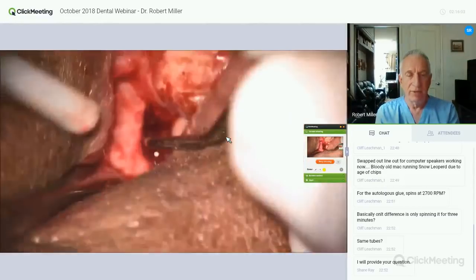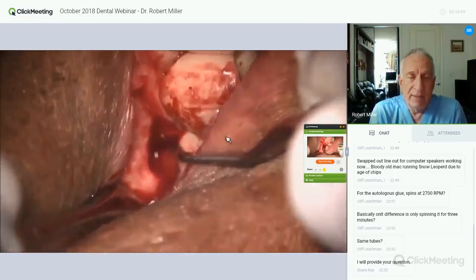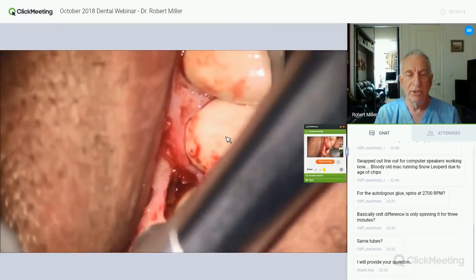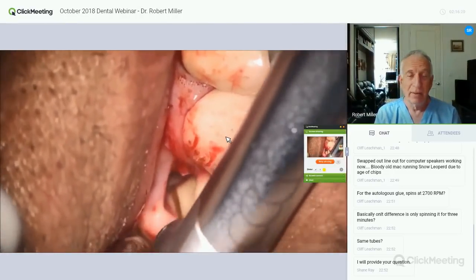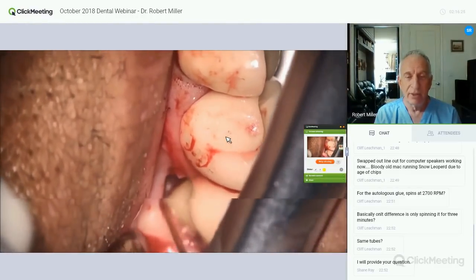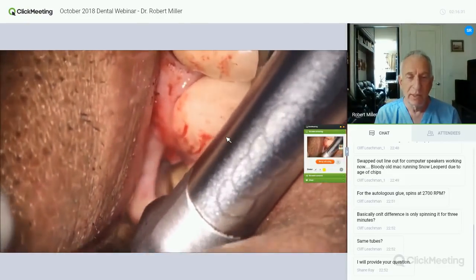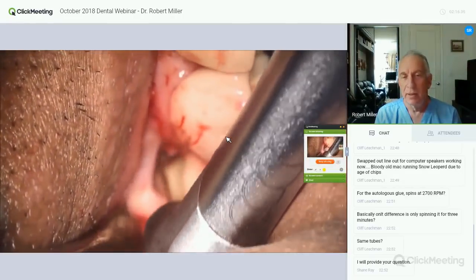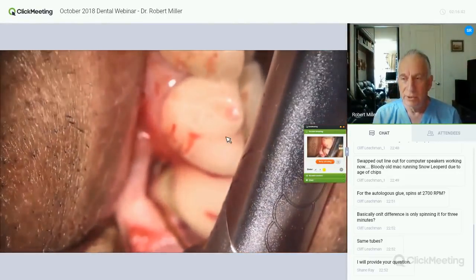And there's going to be a few different instruments in here. I love to use lasers for this. I find that the debridement with a laser is not only very, very effective in removing any shreds or tags of granulation tissue, it also helps me to decontaminate it through a direct laser action and through something called the photoacoustic effect, the shock of the laser going on and off in an erbium-based laser. This is from BioLase, the WaterLase MD, or the WaterLase I+ now that I'm using. Okay, and just make sure that you've removed all of that granulation tissue.